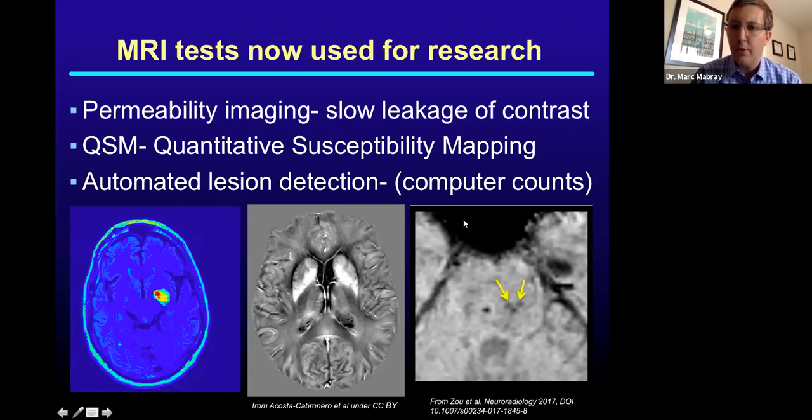Dr. Hart and I both worked on this within the context of the Brain Vascular Malformations Consortium study. We annotated a whole bunch of research scans, and then some of the scientists at UCSF helped with this and developed an algorithm that tries to basically flag small cavernous malformations.